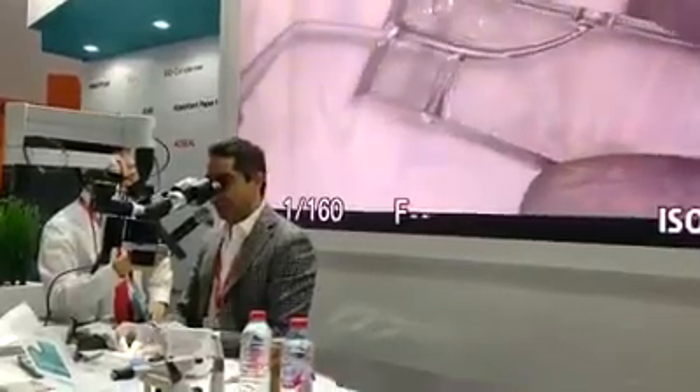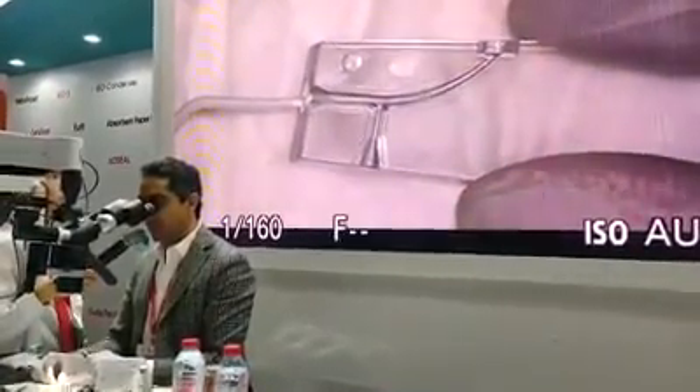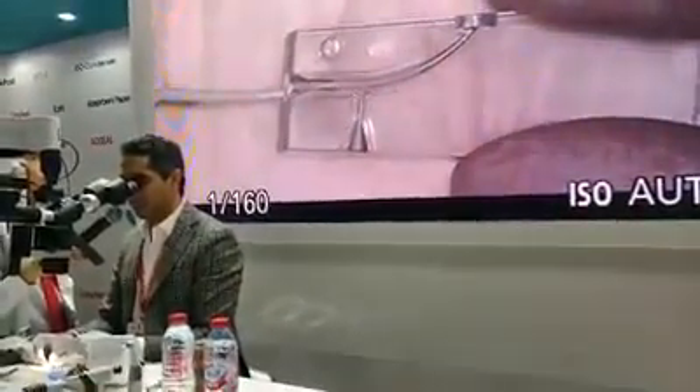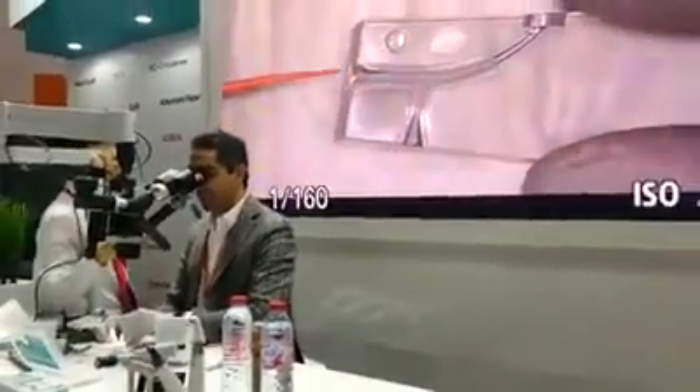I will go with the TheraSeal inside the root canal and start injecting it. You can see the flowability of the sealer already, without using any gutta-percha and without any condensation of the gutta-percha.